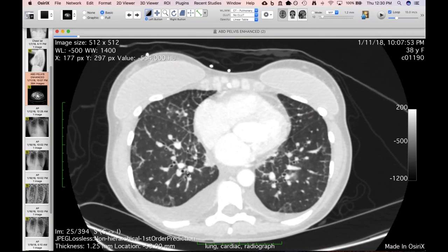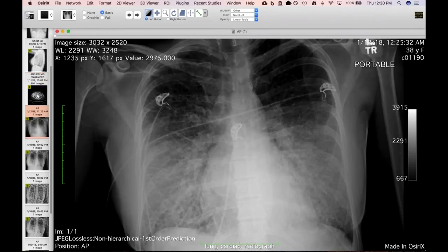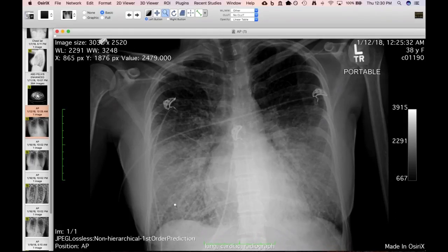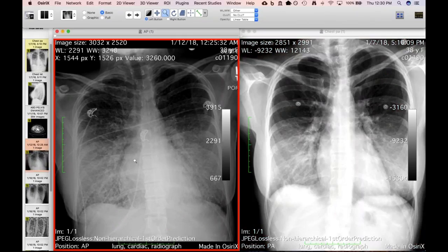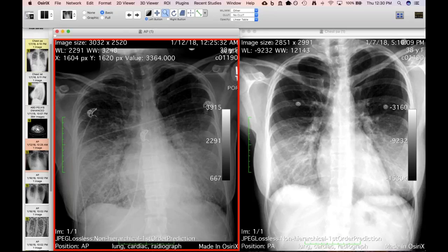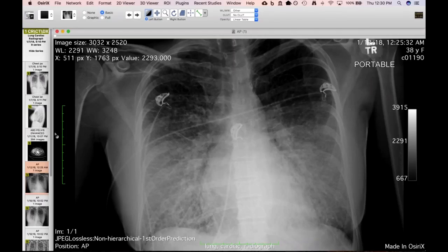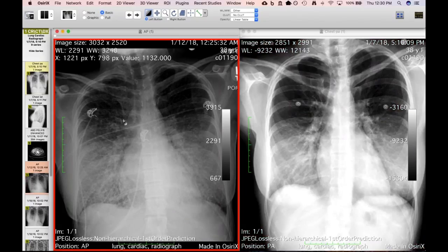Maybe the mitral valve explains the asymmetry. The left atrium also looks larger than it did five days before — her mitral insufficiency and valve destruction progressed over a short period. This is also a good example of how the azygous can be used as a marker for intravascular volume.